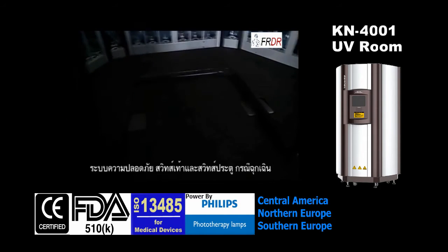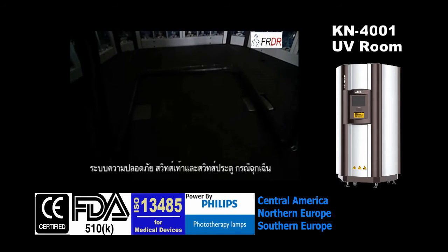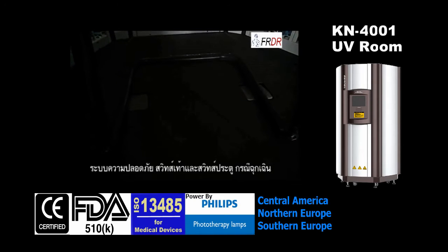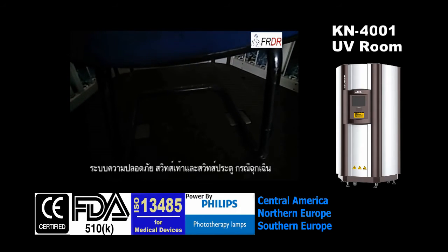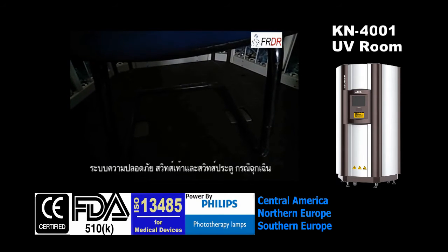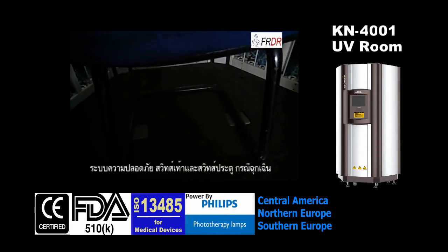Here there are two foot switches to control the treatment. When the patient steps on the foot switch, the machine can be powered on and go into treatment. To protect patient safety, if any emergency happens during treatment, the patient can step off the foot switch and the machine will be powered off.